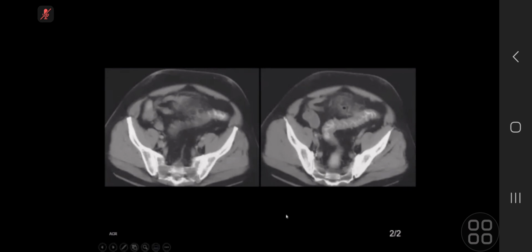So there is a mucosal edema, there is a serrated outline of the muscular mucosa of the sigmoid colon. There's adjacent mesenteric inflammation, and I can see an extraluminal gas locule centered in that mesenteric fat stranding. Appearances are suggestive of localized perforation of diverticular disease, in keeping with acute diverticulitis with sealed perforation.